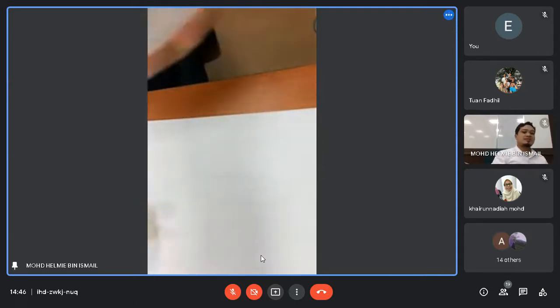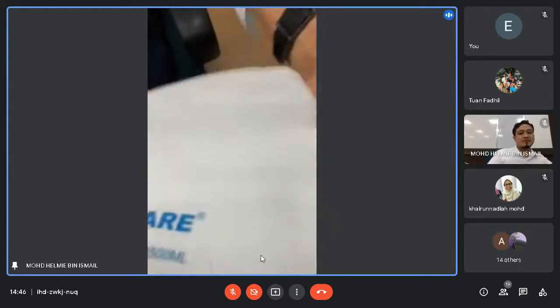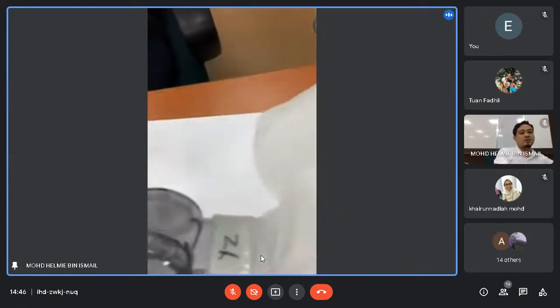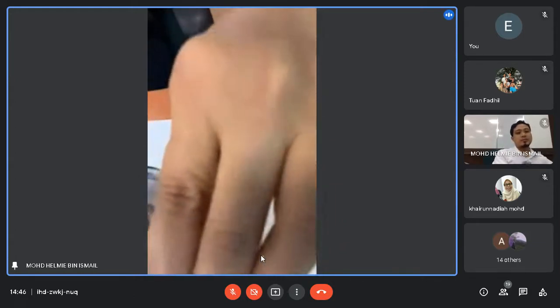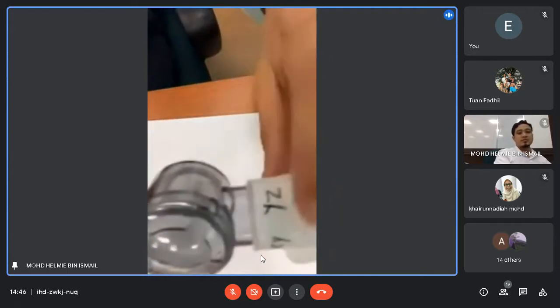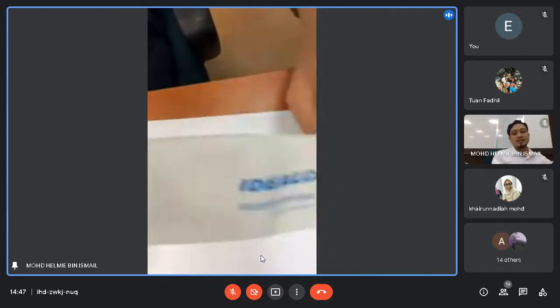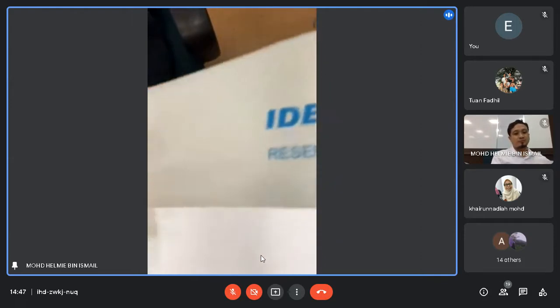Okay. Dia punya anatomy of bag, valve, mask adalah we have a reservoir, oxygen reservoir, which is connected to the bag. This one is bag, and then this one connector, and then this one is an oxygen bag, which is oxygen reservoir.